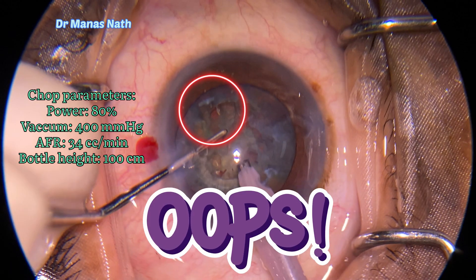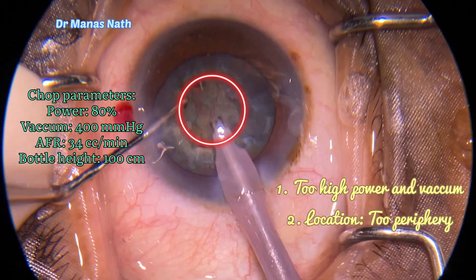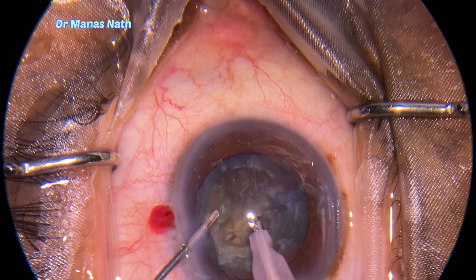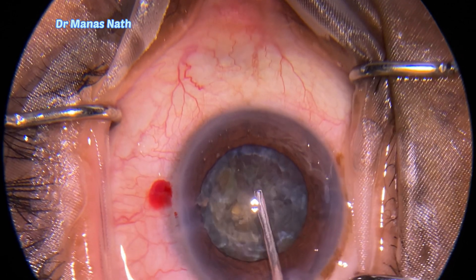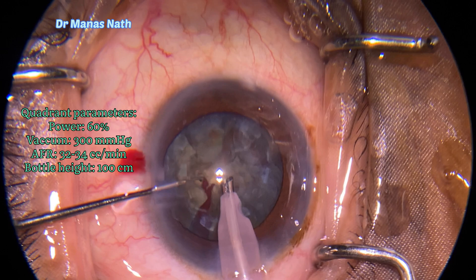With high power and the phaco parameters you can see on screen, my location was too peripheral and I was on too high power and vacuum, because of which I landed up in this punch hole defect. I decided to stop here, injected viscoelastics, tamponated that part.